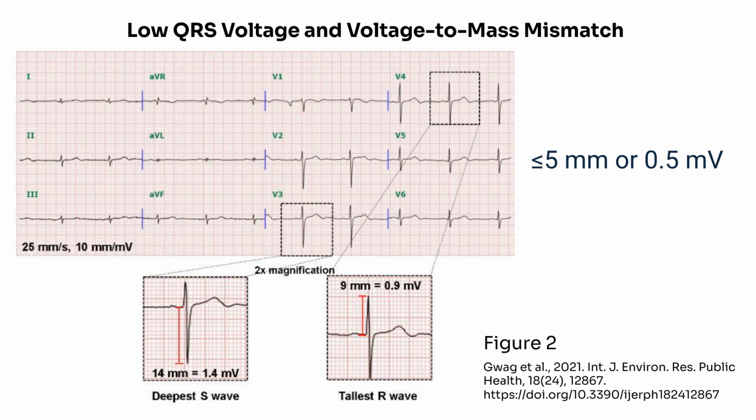As shown in Figure 2, the QRS voltages are dramatically reduced across all limb leads, with small R waves and reduced S wave depth. This type of ECG pattern should immediately raise suspicion for infiltrative cardiomyopathy, and ATTR-CM should be high on the differential.